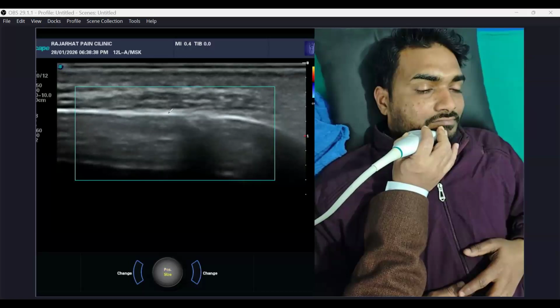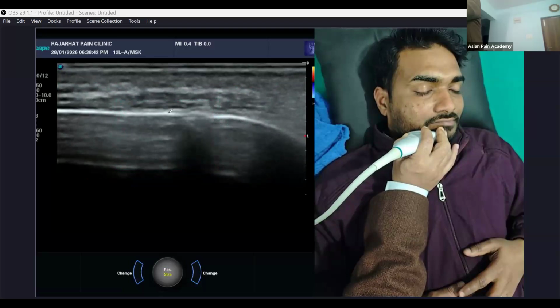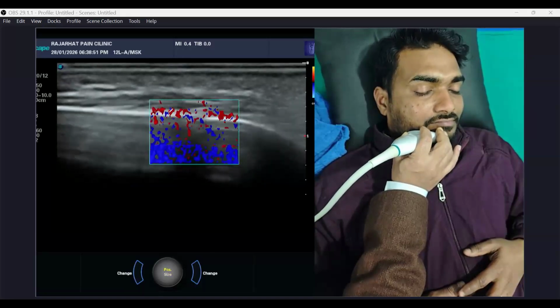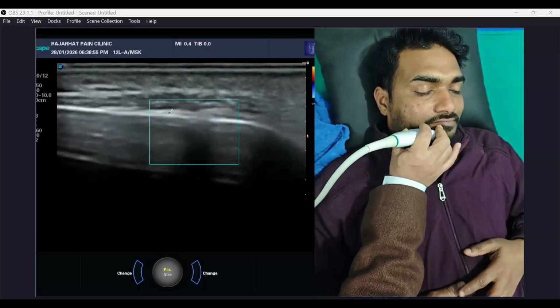Sir, so I will hit the bone everywhere when I needle. Actually, these blocks are very superficial blocks, but I am telling again and again. So what happens every time when you go, you just inject close to it. All are very superficial blocks.